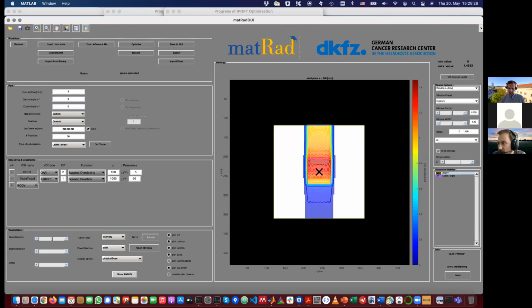So there are ways to exploit these alpha betas, but that really requires heterogeneity and infiltration knowledge. You need a lot of knowledge about the exact distribution, the tissue types, and the alpha beta parameters that you just don't have. So there's quite some magic behind that in a sense, and you do not want to get involved with magic. You want to stick with what you can safely say is okay.